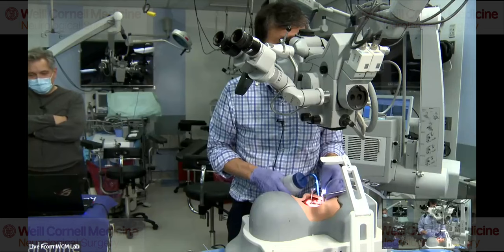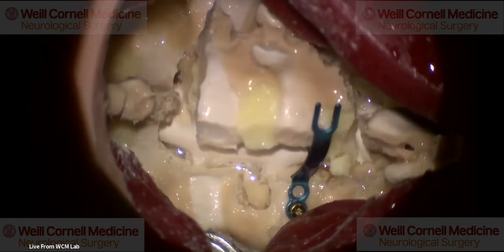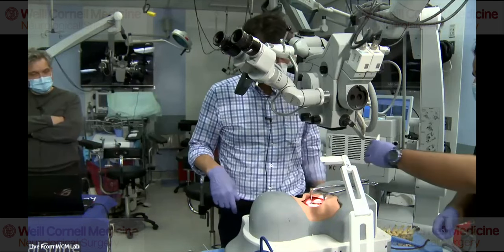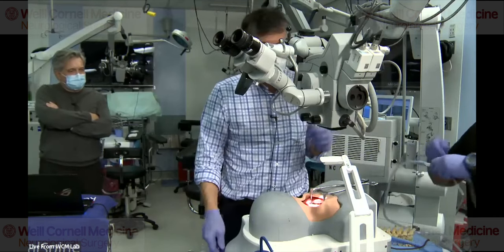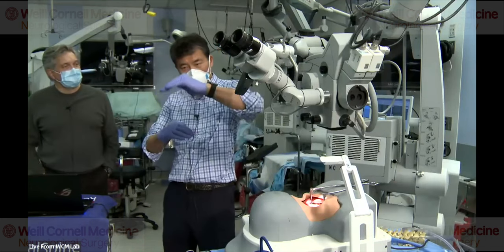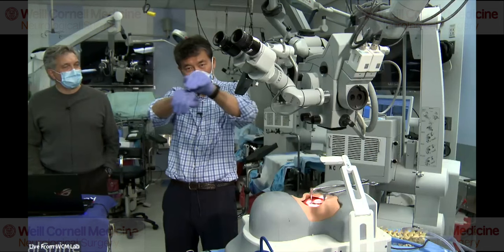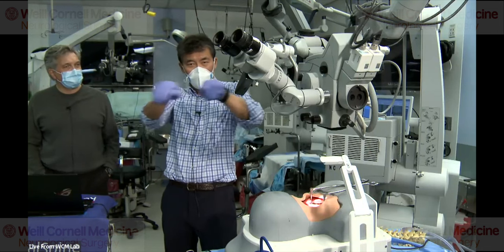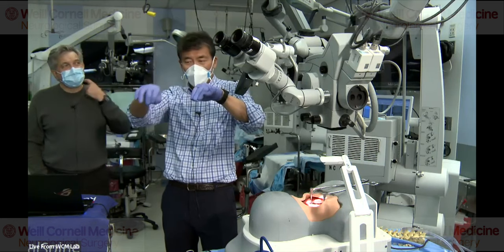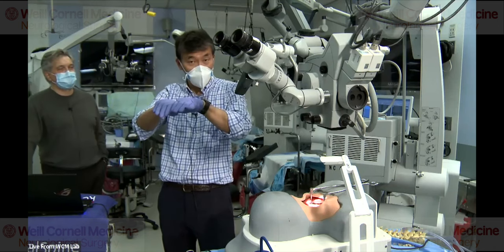So make sure that all the bone dust is gone. And then that's when I put the epidural Depomedrol in there also. One last thing you've got to make sure to do, another reason that you get loss of motion, is that you hinge one lamina up and you hinge another one, and if you didn't do it right, they don't shingle. They end up hitting each other. So what I do then is I take a burr and remove all of the bones. And then I extend the neck to see that there is no bony block to full extension.